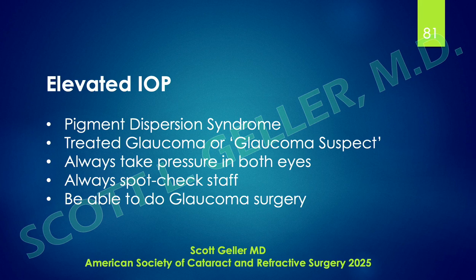He was being treated for elevated pressure with some medication. Went in for his initial examination. The Tono-Pen pressures were consistent with what the other doctor had. The ophthalmologist did his laser thing and told the patient to come back in several weeks.